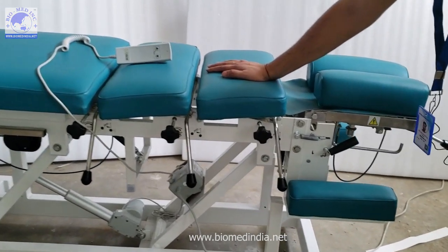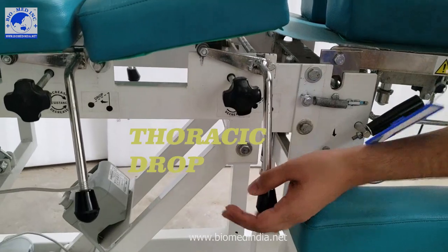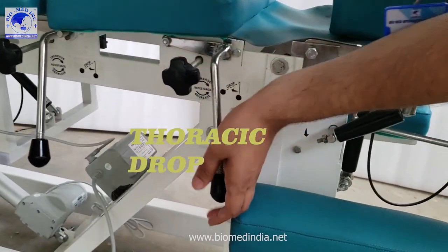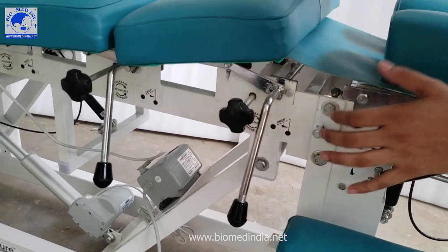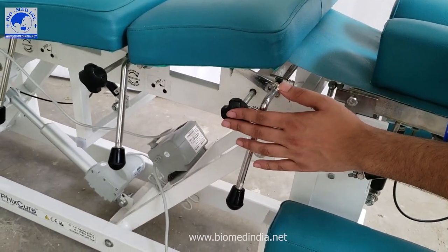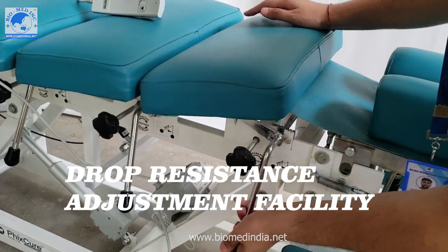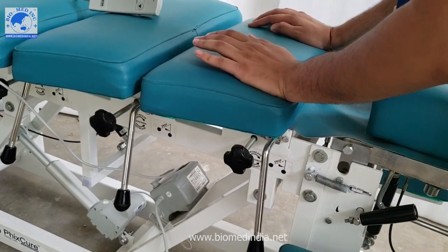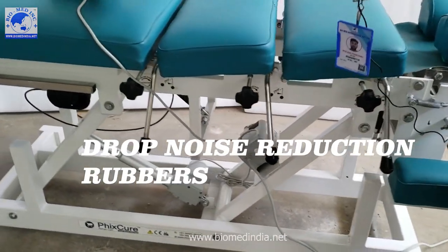This is the second drop — the upper thoracic drop. These are the side drops, and as you can see we have instructions provided here as well. All drops have an increased and decreased resistance system with each notch. We have also included a special rubber that helps reduce the sound of the drop.